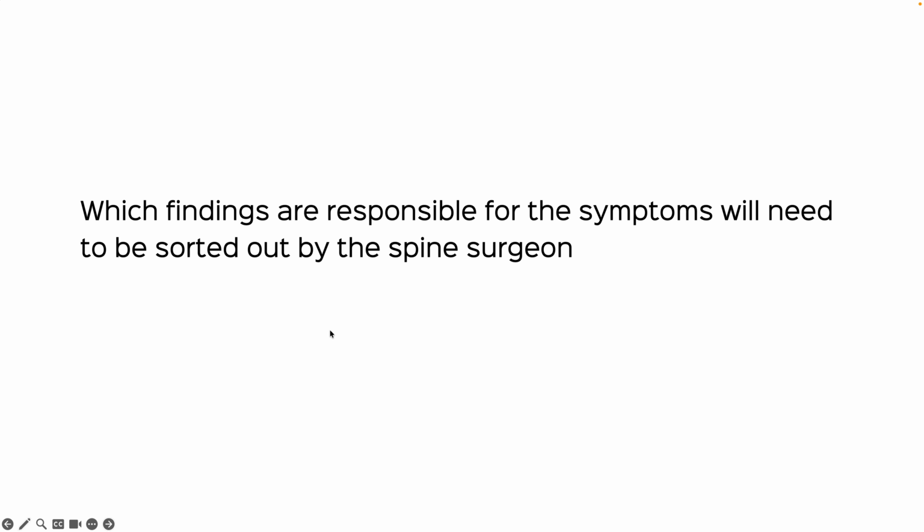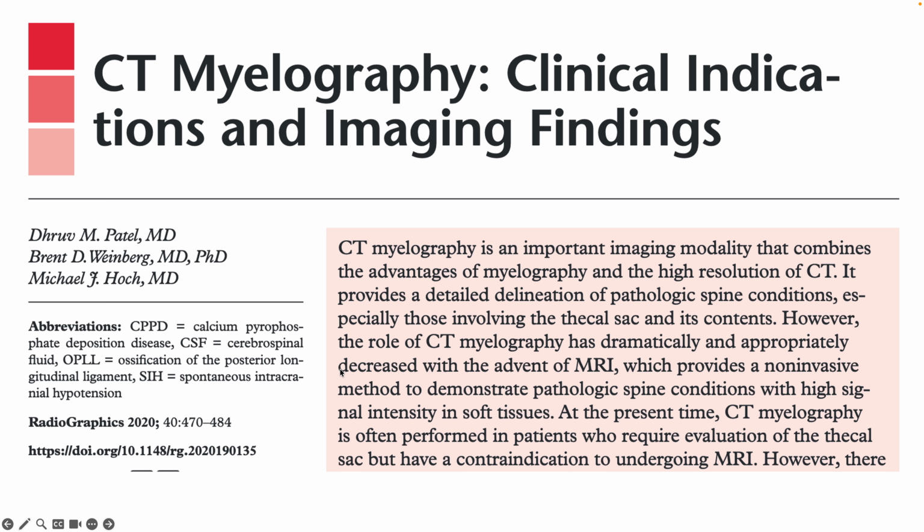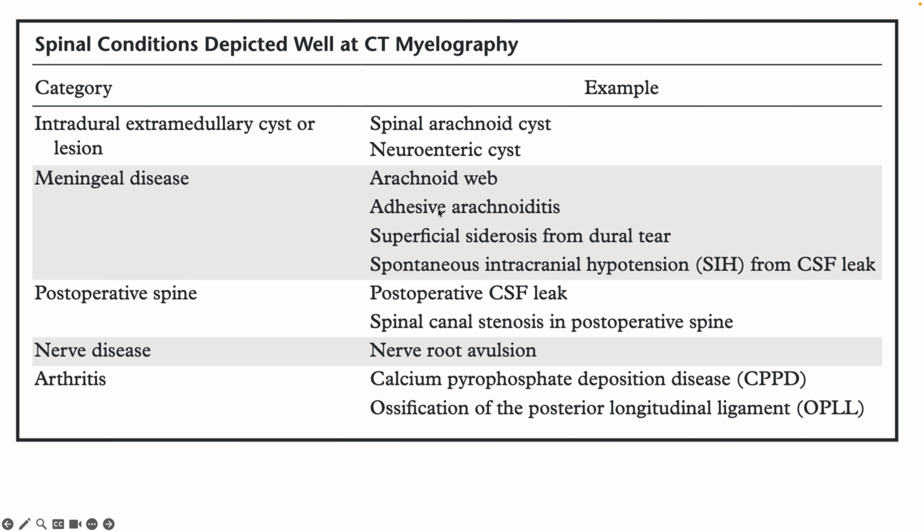Now, which findings are responsible for the symptoms will all be sorted out by the spine surgeon depending upon the specific issues that the patient has. Now, there's a lot of literature on CT myelography for CSF leaks, using dynamic methods, etc. We don't do that, but probably the last paper on CT myelography of any relevance was 5 years ago, which was a review article in Radiographics, and these are all the indications that were mentioned.